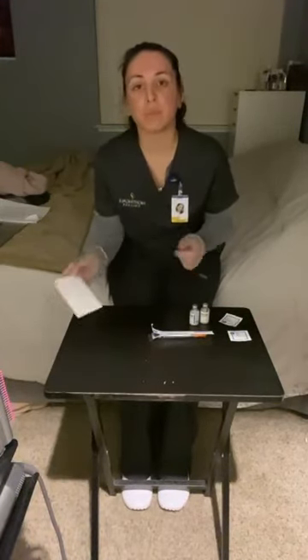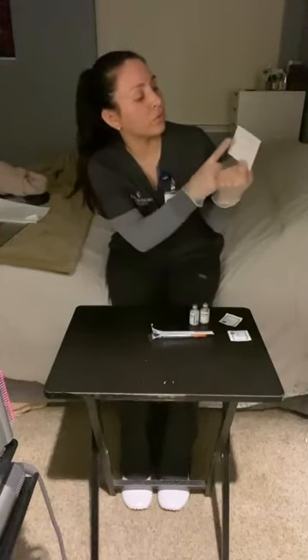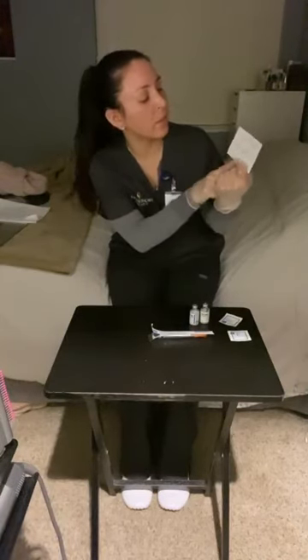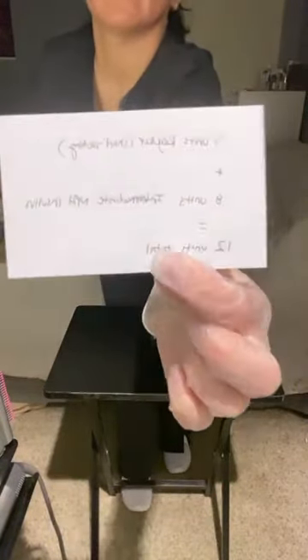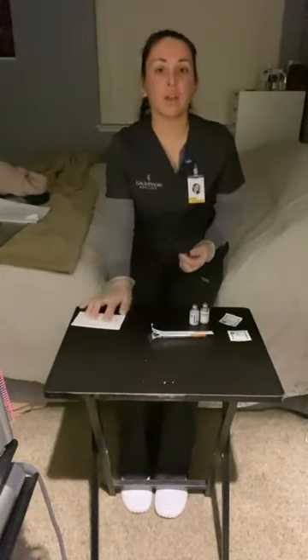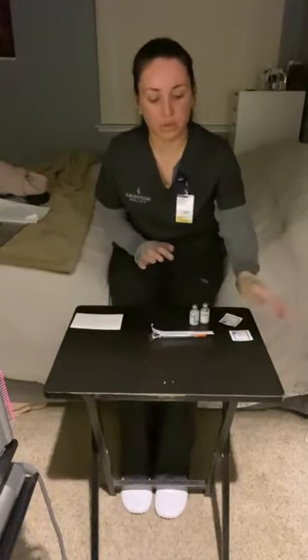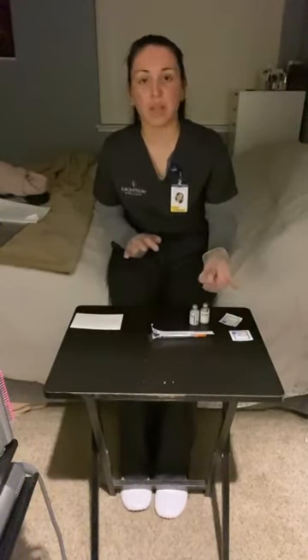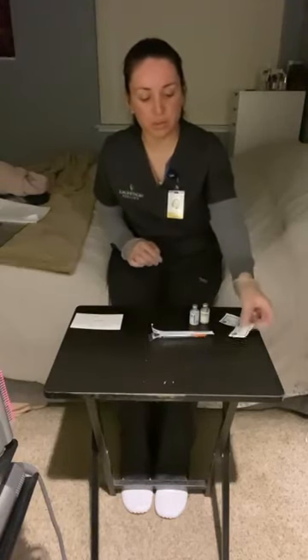So we are doing 4 units of the short-acting regular insulin and 8 units of intermediate insulin for a total of 12 units. And I would ask another nurse to verify. Next, I would grab an alcohol swab. If they're new vials, I would take the caps off. I would clean the tops of the vials.